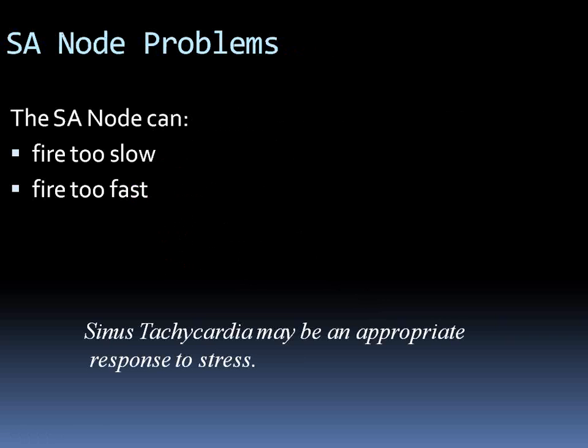When you talk about arrhythmias that come from the sinus node, most of those are a normal physiological response to stress. Okay? For example, when we run a marathon, or when we are stressed out and taking a test, those arrhythmias are most likely sinus tachycardias. You will see a P wave with every QRS, and the only thing you will find is that the rate will be more than 100 beats a minute.